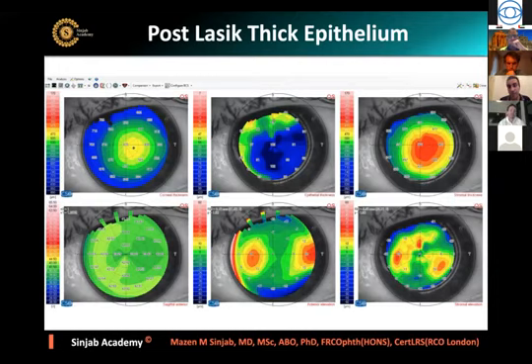In theory, I would still proceed with the transepithelial approach if I can. Everybody might have a different technique, but I have a certain formula that will translate that thickness into the laser, because it's going to be a different reference point, even much higher. Then I check it by OCT and double check through several HD quadrants that my calculations align with what I see. And I would still proceed with it. You could always remove the epithelium again, but that's a completely different game, and I don't know how the epithelium is going to heal.